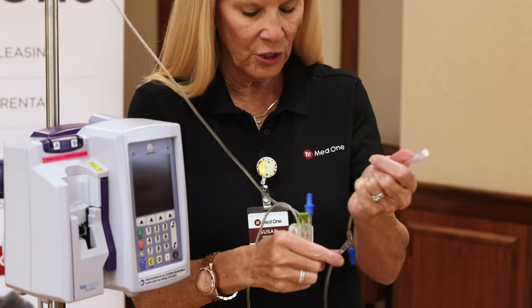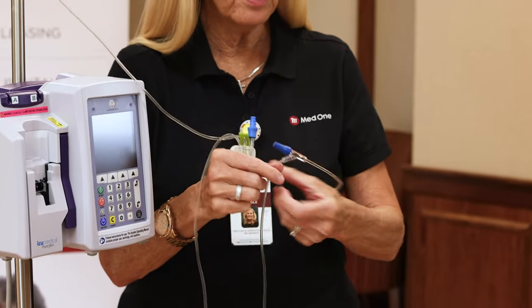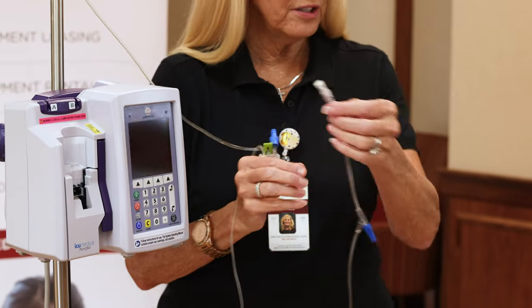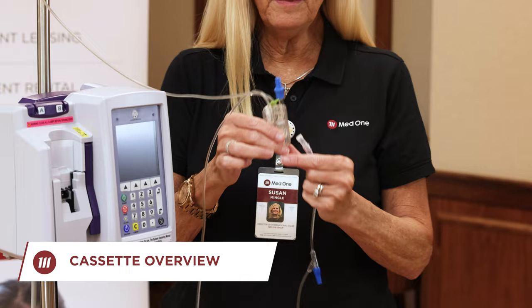Fluid will then continue to move down your line. Once it gets to your clave, tip and tap that port to knock out any air that may be in there. The protected end cap will fill up with fluid so you can keep it sterile until you're ready to hook it up to your patient.